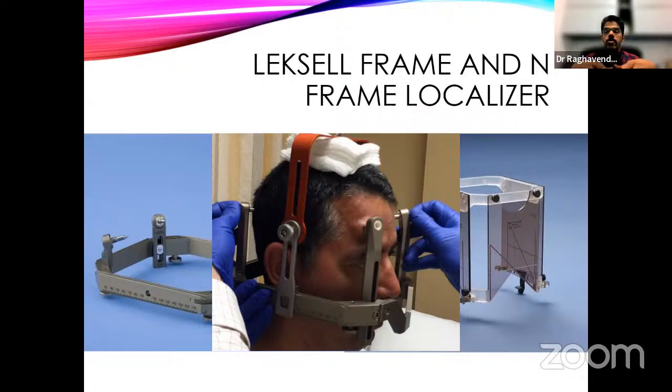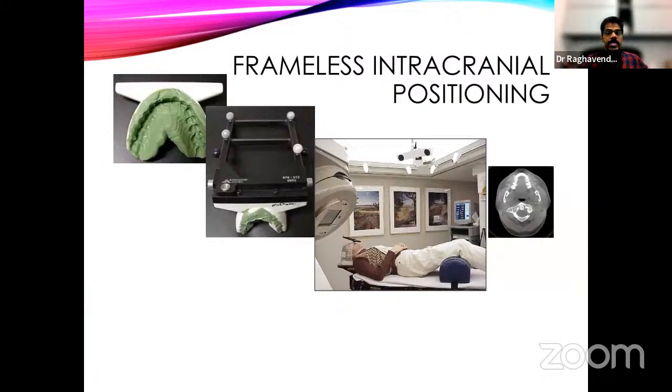Patient cannot go home, or patient cannot be admitted with the frames on. So that is one of the major limitations of this. It is invasive. It is not at all user friendly in that aspect. So immediately the invention started to come out with a frameless intracranial positioning. Here it does almost the same work as a frame based one, but of course the accuracy of the frame based one cannot be questioned.